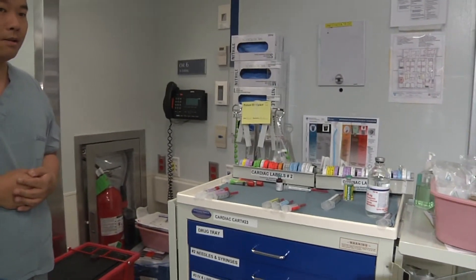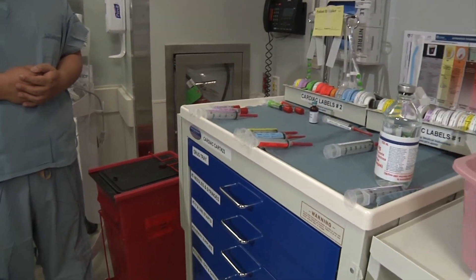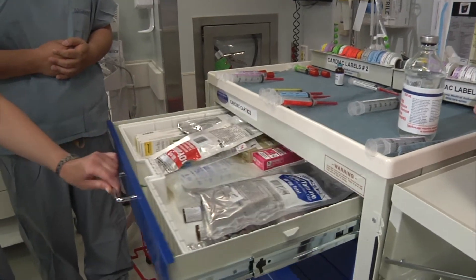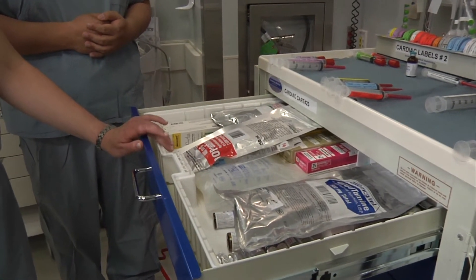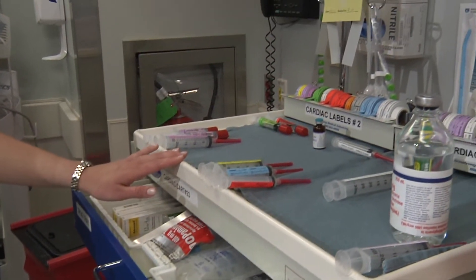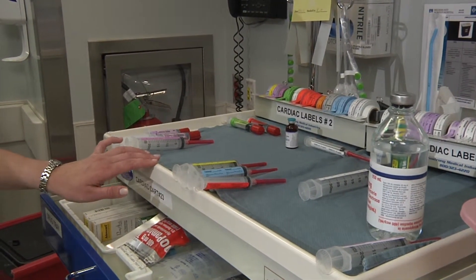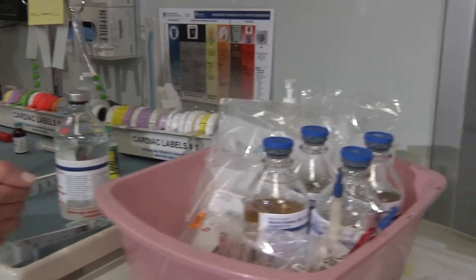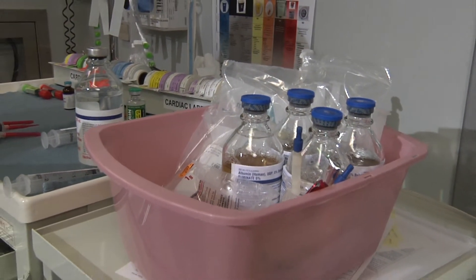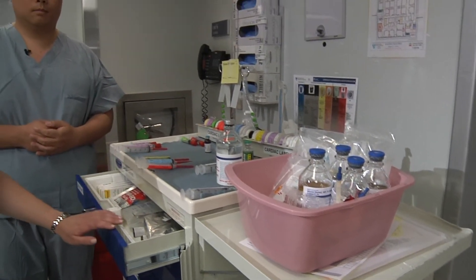Let's focus on the anesthesia cart. Keep in mind that the anesthesia cart in a cardiac room is quite different. Remember that in the first drawer, we have the non-controlled resuscitation medications. And then on top of the cart, we have all of the medications needed for induction and the beginning stages of the case. In a bucket on the side, we have some extra medications — discuss with your attendings which extra medications you may need before checking them out from the pharmacy.